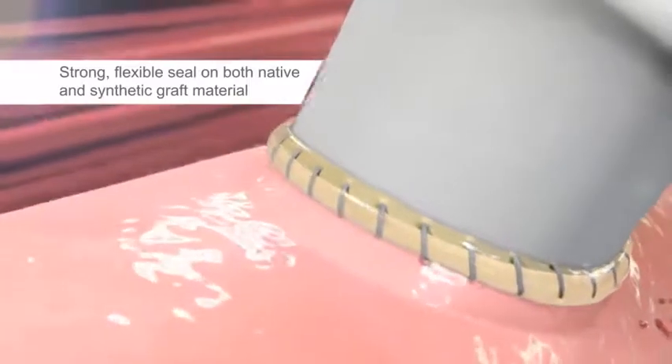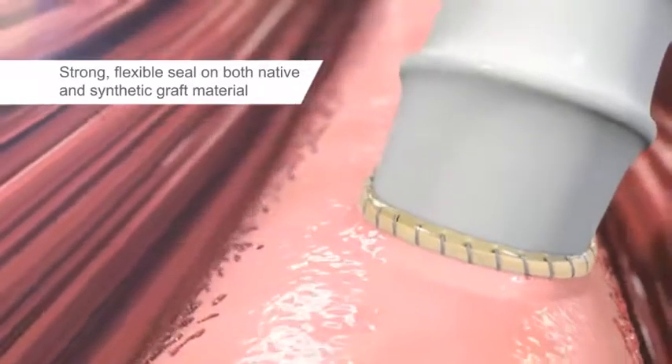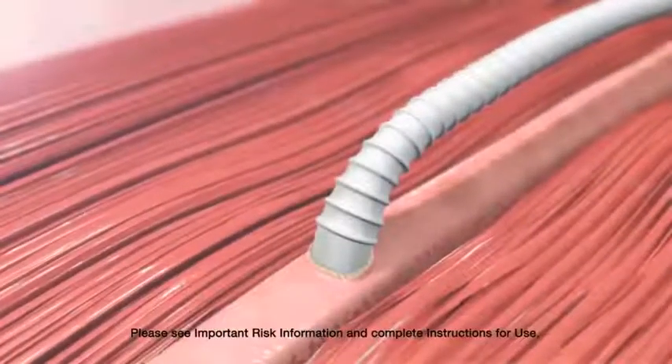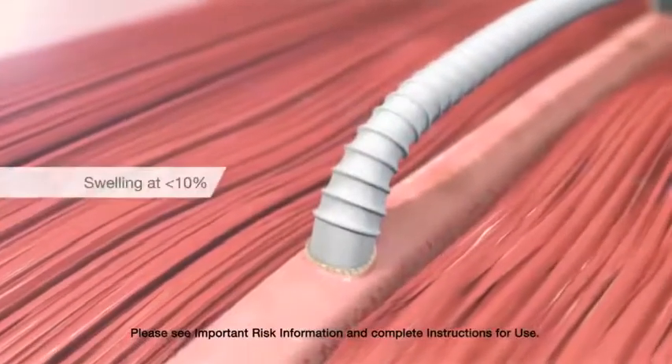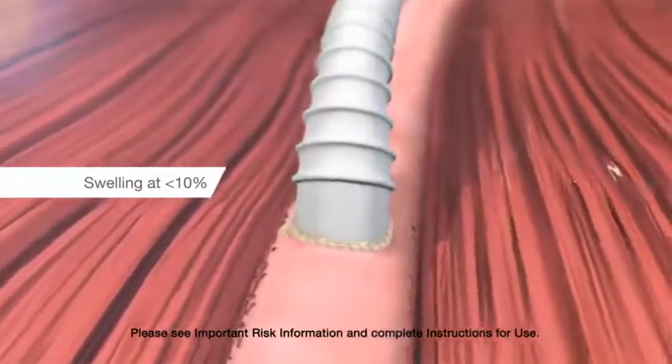While strong, Previleak also has the flexibility that supports natural functioning and movement of vessels. It stays flexible after application to the site, making Previleak useful on highly pressurized vessels. Because there is minimal swelling with Previleak, it can be placed on small vessels where swelling can be a concern.